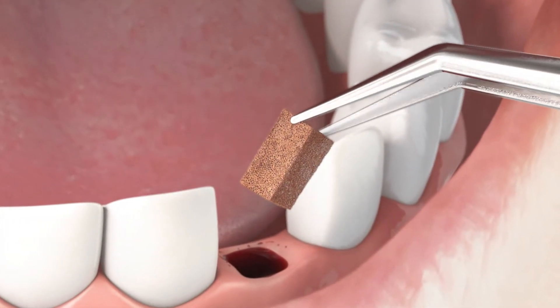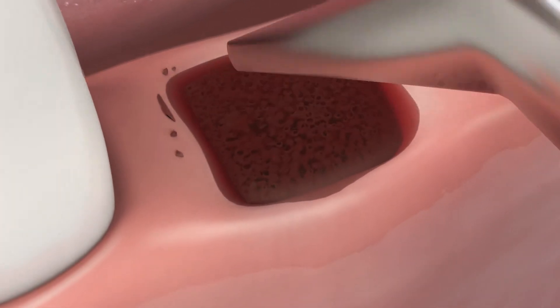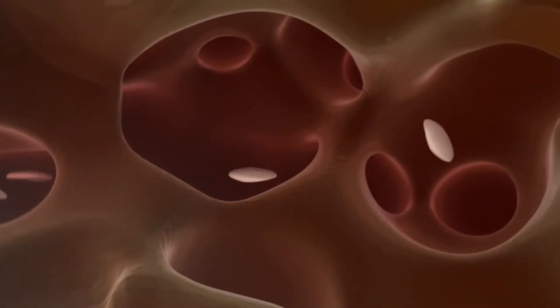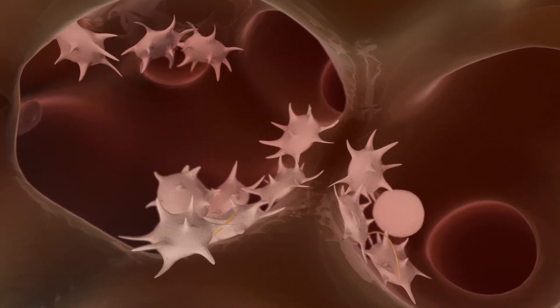The porous sponge structure of Gelatamp promotes quick haemostasis. Gelatamp absorbs up to 75 times its own weight in body fluids. This facilitates thrombocyte aggregation and thus optimally supports the blood coagulation process.